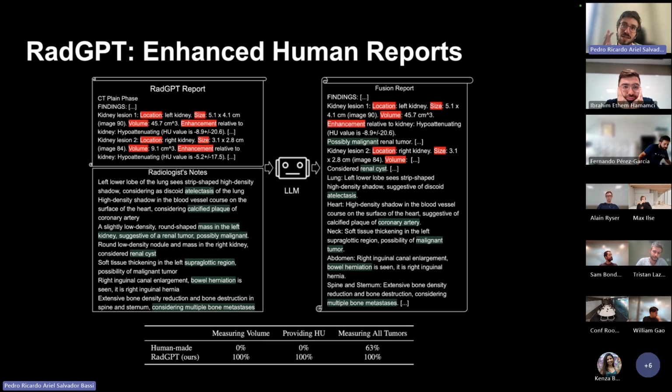Well, as you can imagine from my talk until now, the reports that I mentioned until this point are based on the segmentation. So we use the segmentation to create the reports, and this is based on tumor segmentation. So the main focus of these reports is tumors. They have much information about tumors, but not the other findings that we can see in human-made reports.